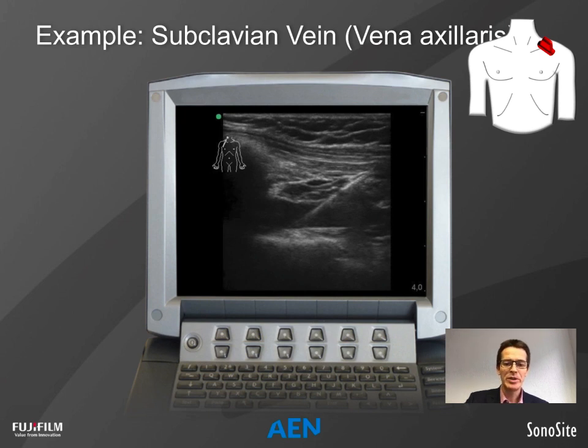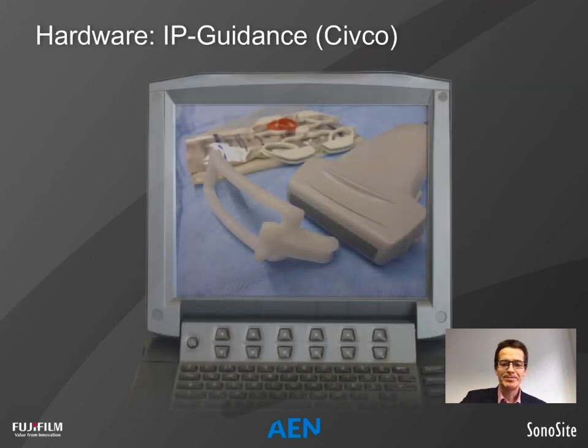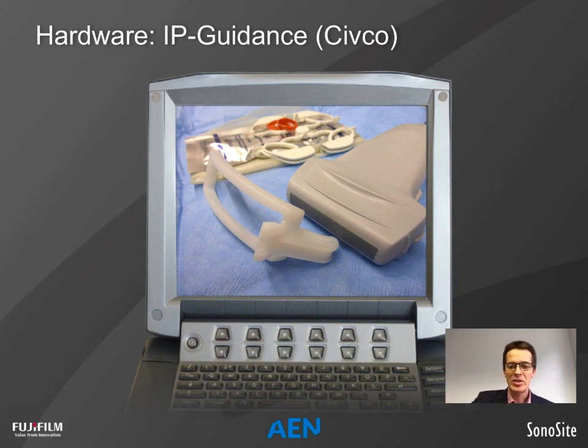And here again you can see how the guide wire is placed directly into the vessel. Some experienced users do not use syringes anymore on the needle. They pre-position the guide wire inside the needle, place the needle tip inside the vessel under direct vision, and then insert the guide wire directly. This is quite smart actually, but only for experienced users.